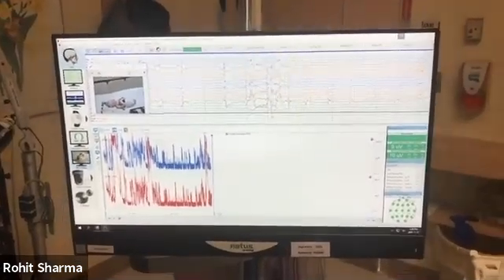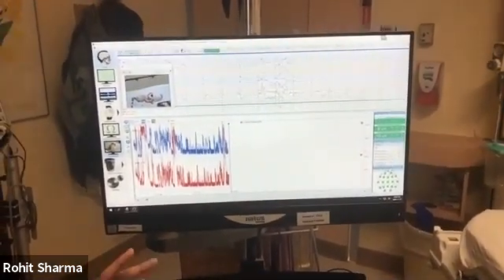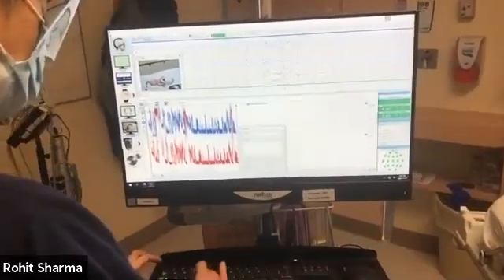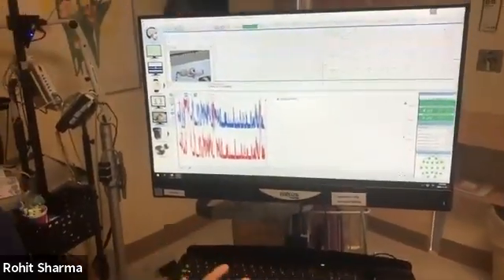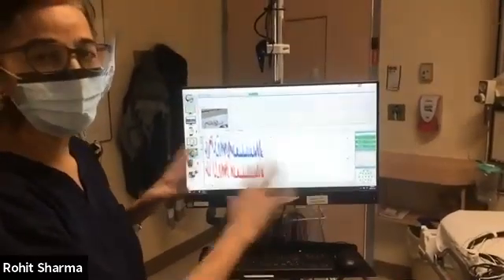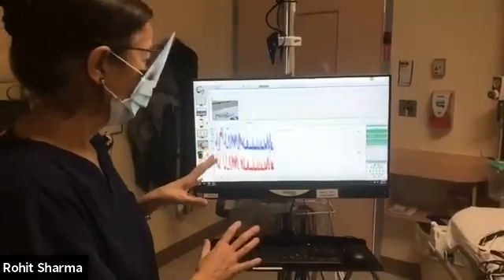If the patient is going to CT or MRI, we appreciate it if you just annotate, just start typing on the keyboard saying going to CT or MRI or any other procedure. Just type it and we know that the patient's gone. So when the patient is disconnected from the system, we'll know that it's because they've gone to another procedure.